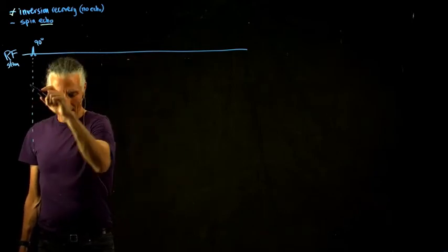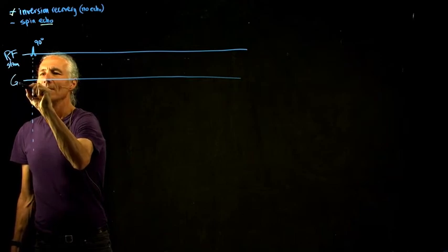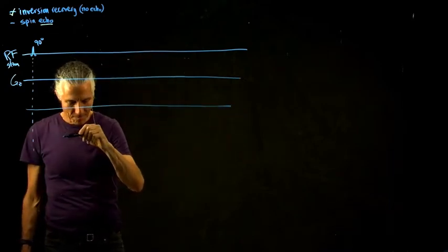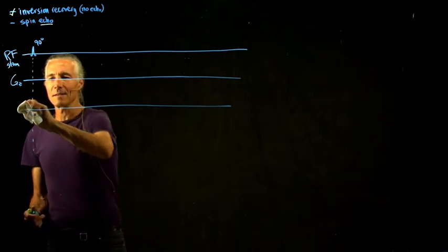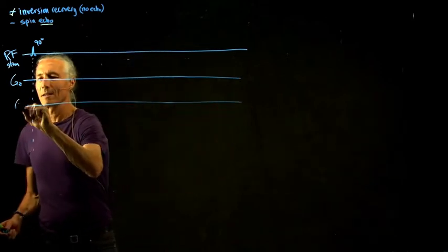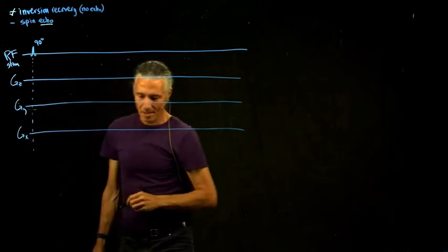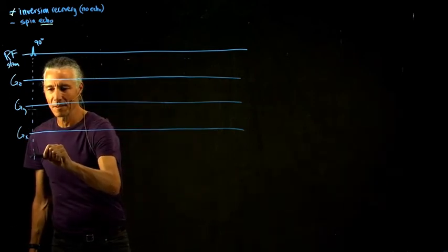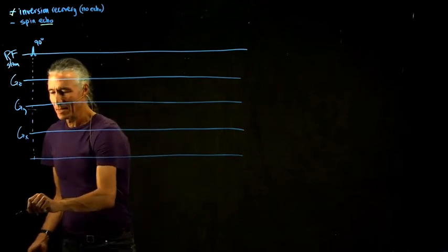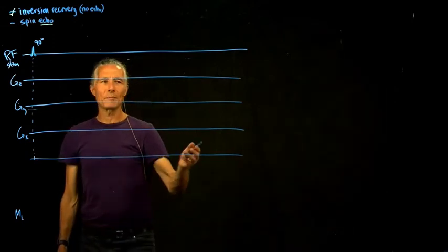And there's a couple more things going on here. So I'm going to draw out all the gradients. So here's the Z gradient, because there's several of them on at the same time. And here's the, need a little more space than that. So here's the Y gradient, and here's the X gradient. And then last but not least, the signal we're getting down here. And then underneath, I'm going to draw out the same graph I did before, which was the longitudinal magnetization, because that's mostly what we're going to be recording, what we're going to be making equations for.